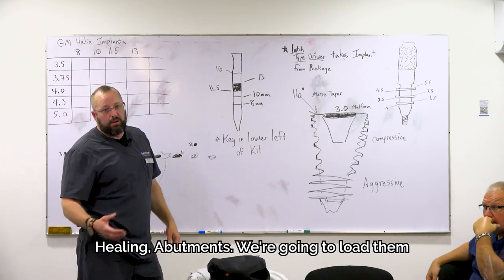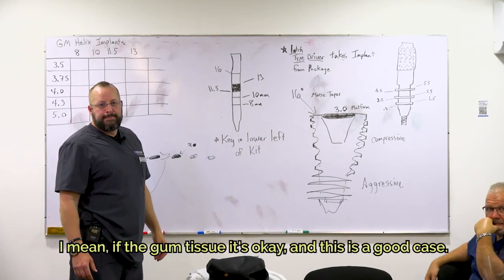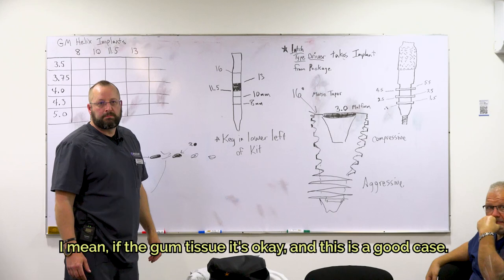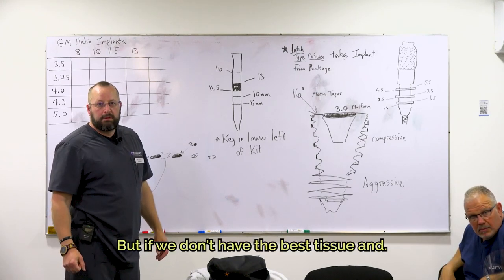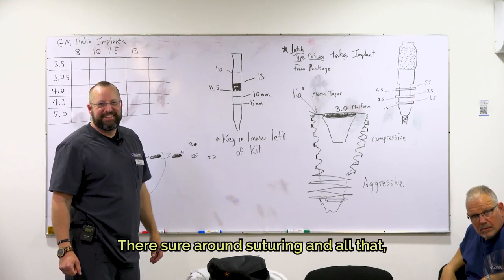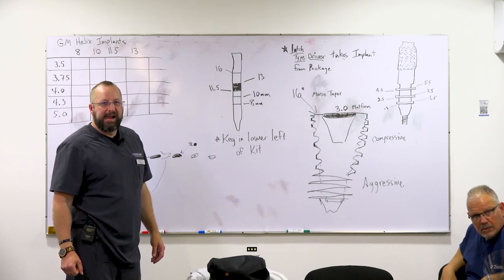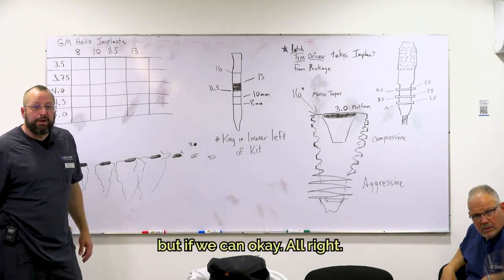We're going to load the all on four cases with multi-units. I mean, if the gum tissue is okay and we see that it's a good case, yes, we can. Okay. But if we don't have stress tissue and, I mean, there's a couple of things there. Sure. Around suturing and all that. We don't mind, but if we can. Okay.